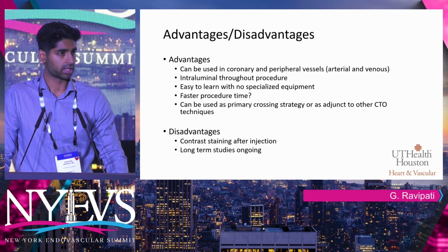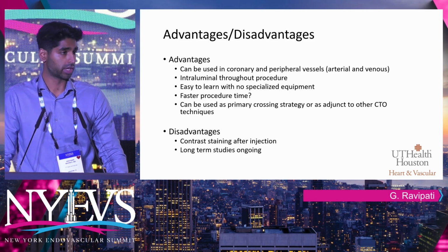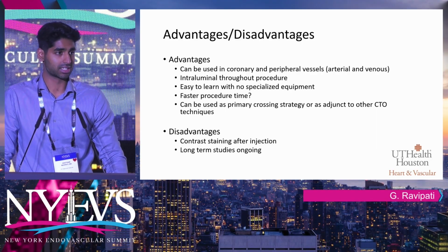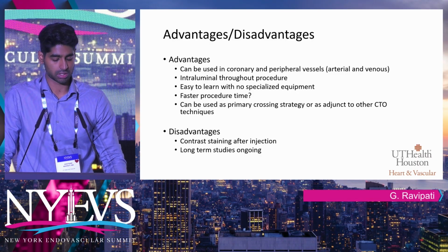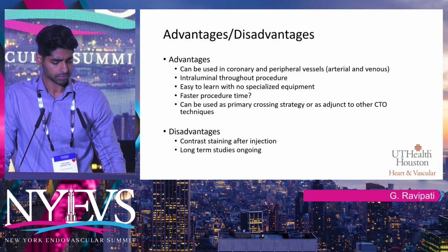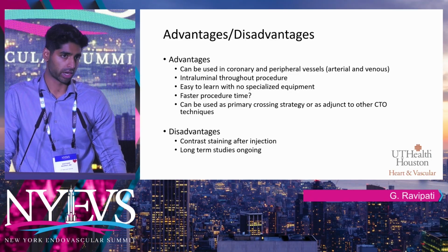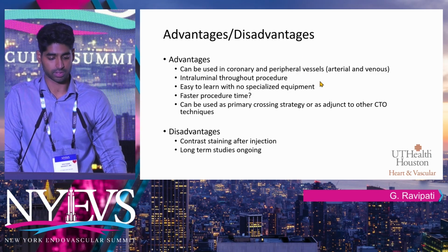The disadvantages, and some of the feedback we had gotten, is that because you're injecting contrast into the body of the CTO, you do get contrast staining. A lot of operators have mentioned, oh, it looks like a perforation, I get very nervous. And that's true, and we actually had to do a whole separate stain analysis to describe what the stains look like after performing many of these procedures, essentially stating that those stains are benign and nothing to be worried about. Long-term studies are ongoing, at least in comparing it to procedural times and how it compares to the traditional wire-based strategies that we have, and also the subintimal devices that we have as well.